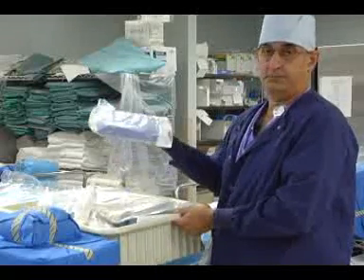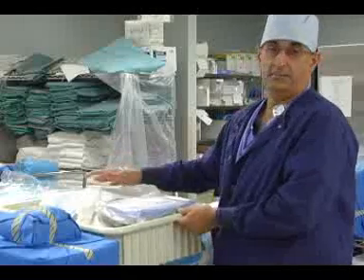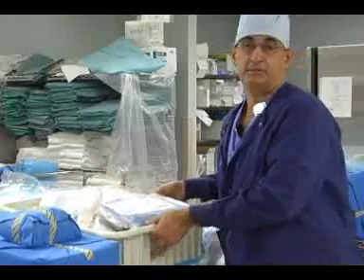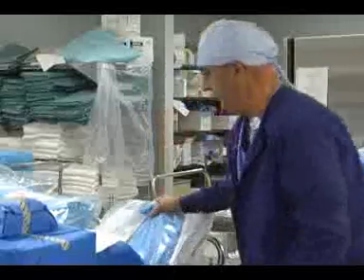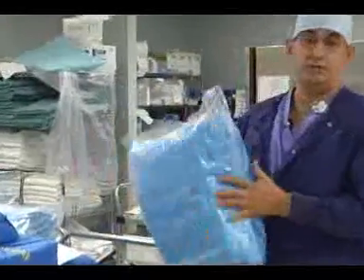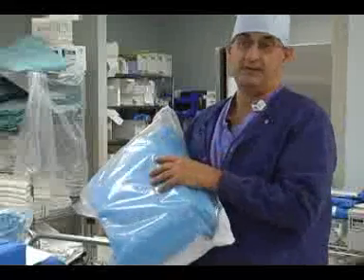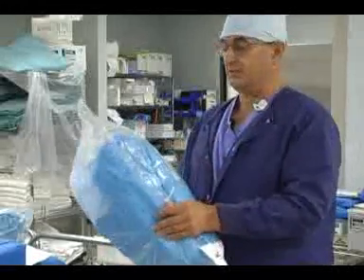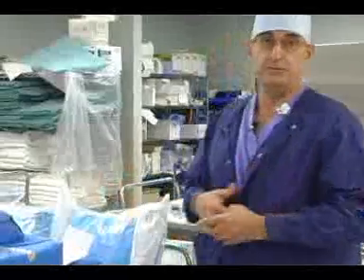That covers gowns for the operating room personnel to wear, draping, and various supplies needed for the case. We also have a pack that covers each one of our sterile tables, and they're also through the sterile process. Inside this pack are the various supplies needed for any case — the sundries that you would need for any of them.